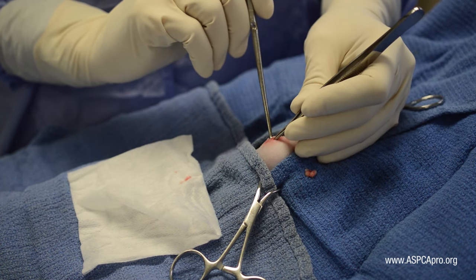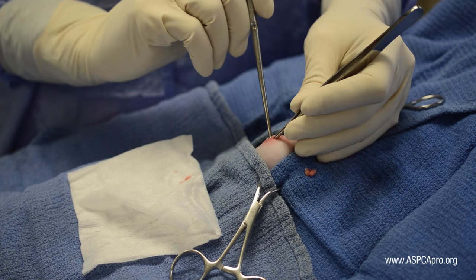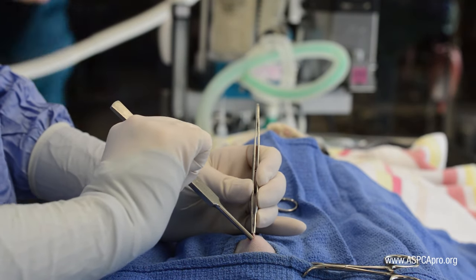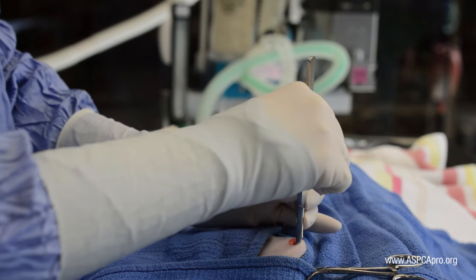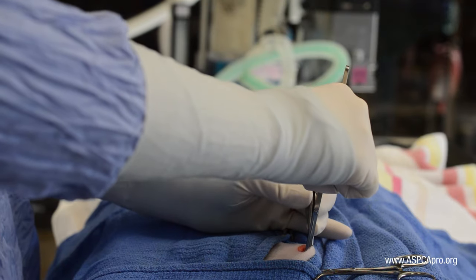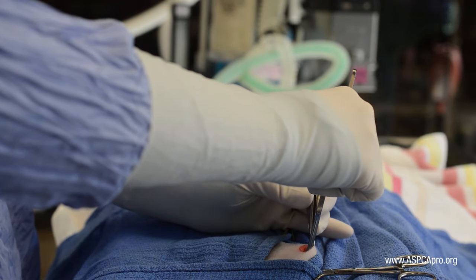While applying a moderate amount of upward traction to the body wall, introduce the spay hook with the hook facing cranially. Then, starting near the incision, press the hook against the abdominal wall and slide the hook downward, staying against the wall, toward the patient's dorsum.